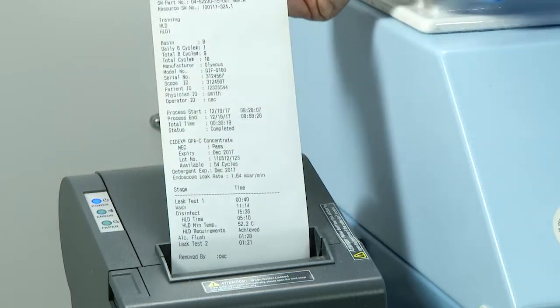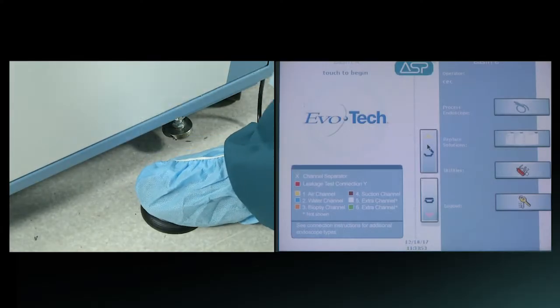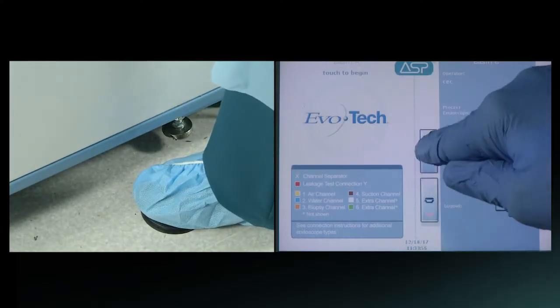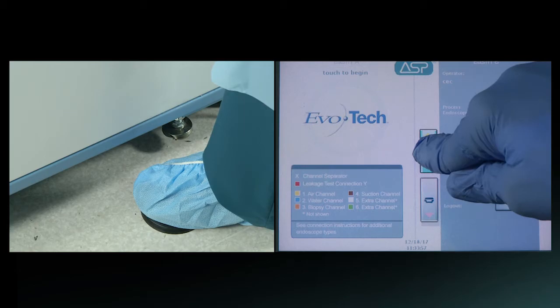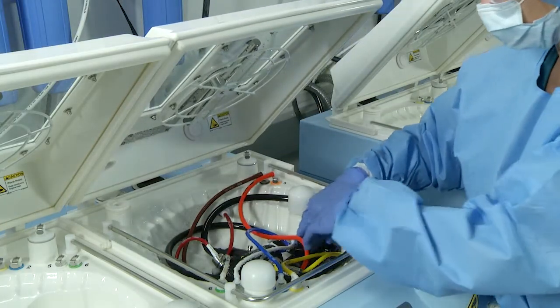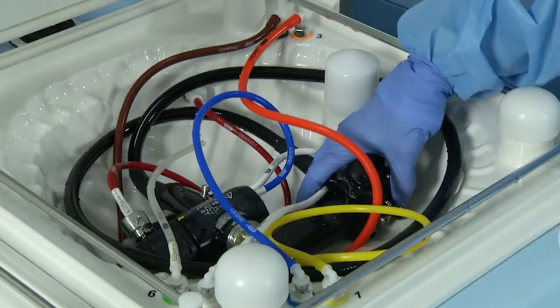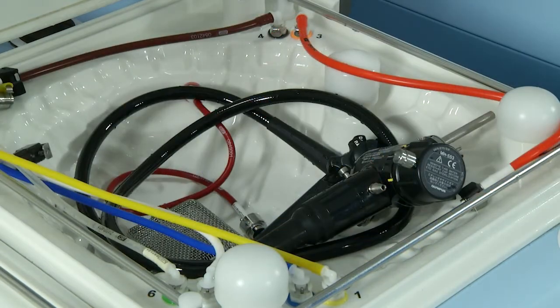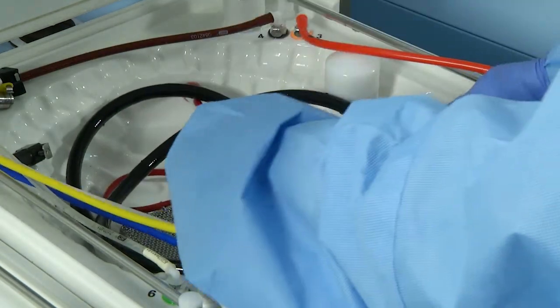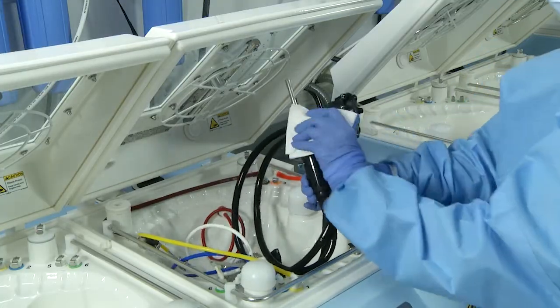Review the cycle printout and verify that the process was completed, the MEC was met, and HLD was achieved. Open the lid with a foot pedal or by pressing the Lid Open button on the screen. Disconnect the endoscope connector and remove the channel separator, if applicable. Then gently remove the scope while drying it with a lint-free towel.